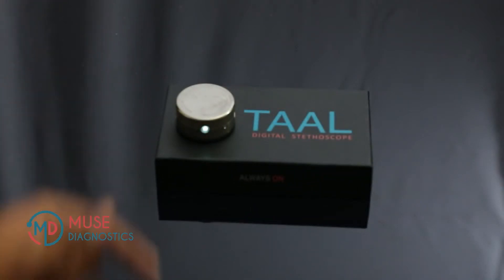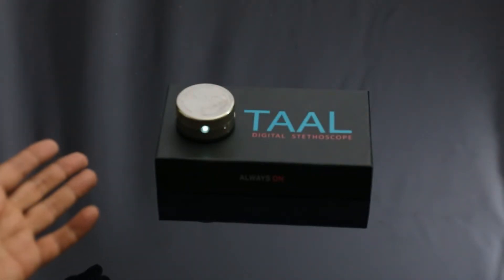Hello everybody, this is the Tal Digital Stethoscope and I'm going to show you how to record body sounds quickly.